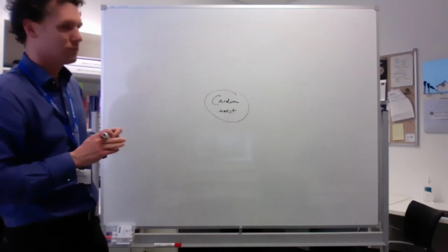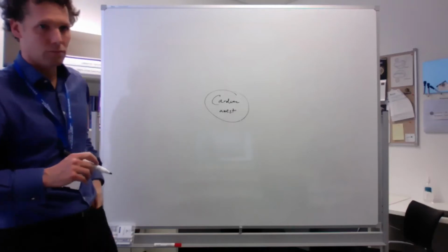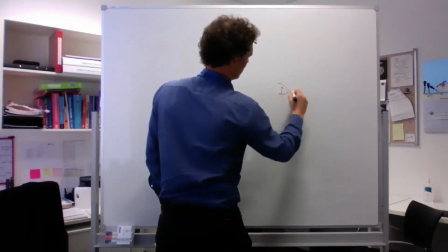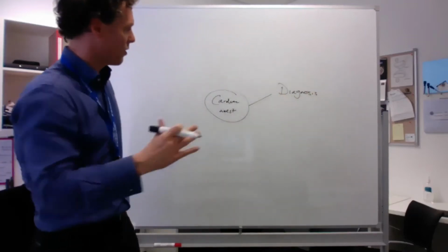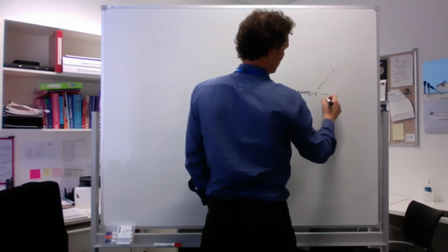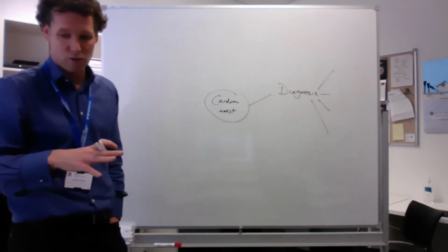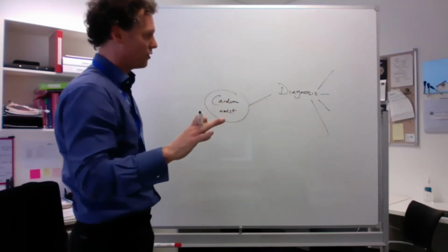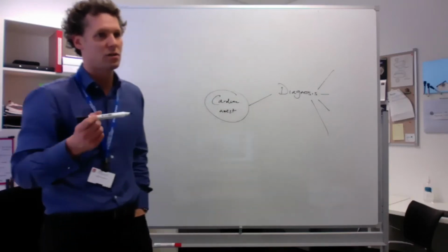So with the use of ultrasound in cardiac arrest, I think the main modalities would be in defining the etiology, so diagnosis, which speaks to the reversible causes. Yep, and just run me through those. So the 4 H's and 4 T's. But particularly it's how it's going to guide your management. Yeah, it's all in the question. So the 4 H's, 4 T's is not going to help you with hyperkalemia. So tell me about how echo helps.